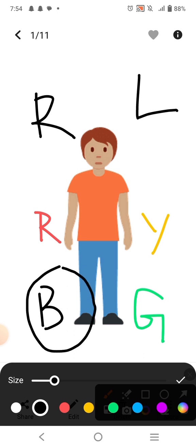But this black colored electrode is considered a neutral electrode. It is not conducting any type of electricity. It is considered a neutral one, or we can also say that it is only used for earthing. So the whole game is between these 3 electrodes.